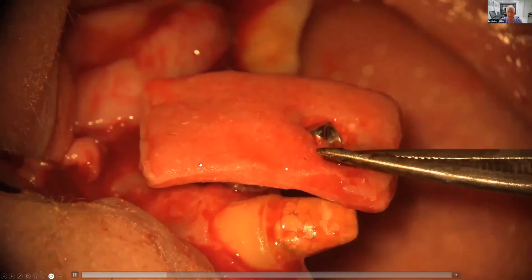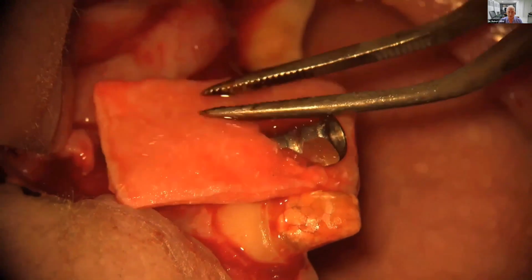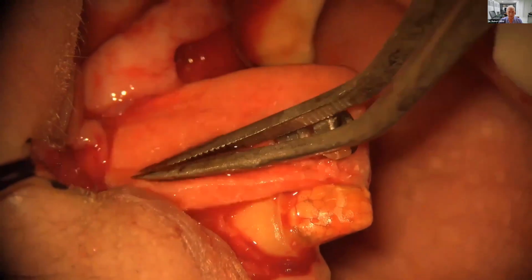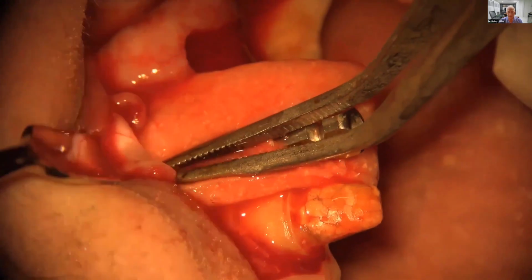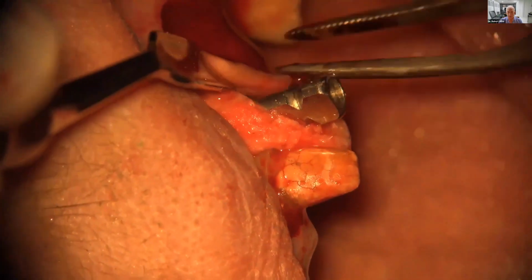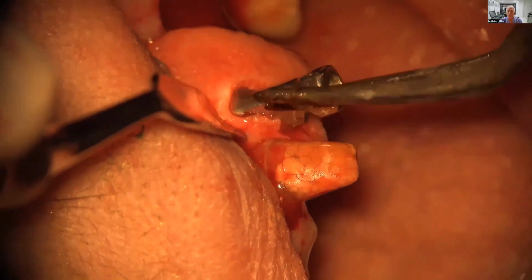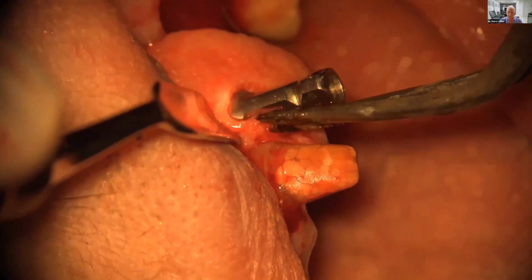So I've placed the implant in its proper position. I've used the tissue punch. I've punched through the collagen membrane. And then I'm going to lay this over my ridge, not just for horizontal growth, but for vertical growth as well.